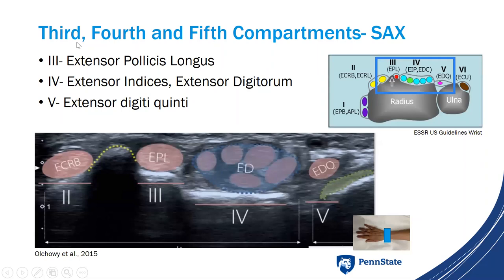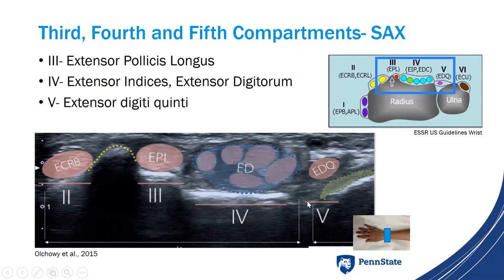Moving on to the third, fourth, and fifth compartments — these can usually be seen together depending on your transducer. Anatomically: the third compartment contains extensor pollicis longus, the fourth contains extensor indicis and extensor digitorum, and the fifth contains extensor digiti minimi. You can see all of these in one view with Lister's tubercle superiorly, the second compartment edge, and the distal radioulnar joint.